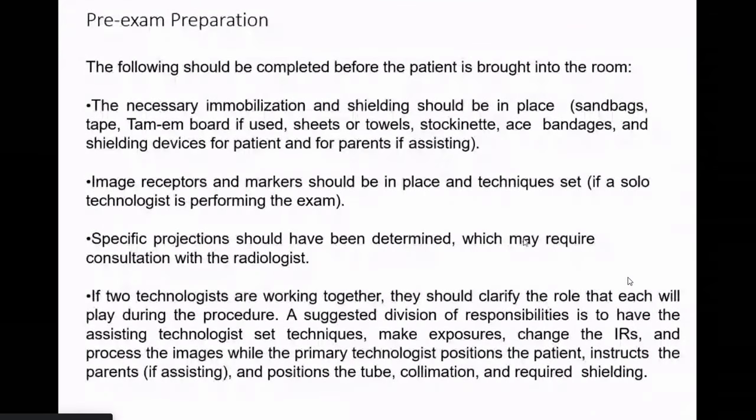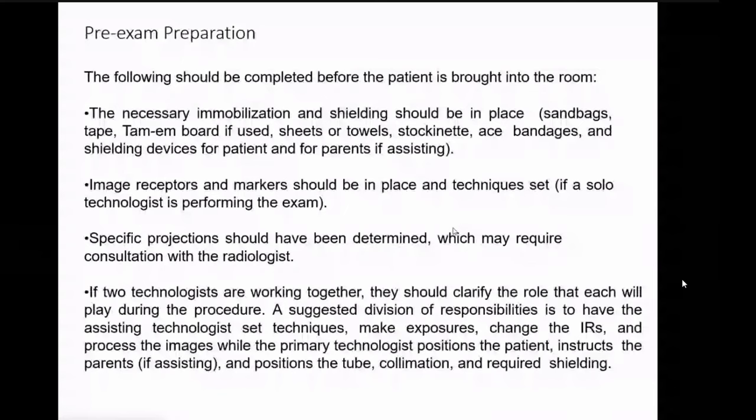Like I explained, the sandbags, Velcro and bed sheets, towels, bandages, and shielding devices. And if parent assistance is required, definitely the parent must be made aware of that. So we can consider that. So yes, the necessary step is the preparation of the room. That means which immobilization device and shielding device we are going to use. We have to be properly ready before entering the patient.